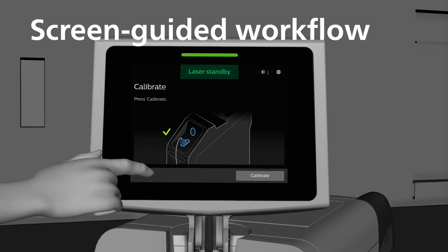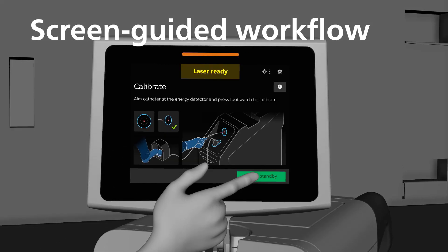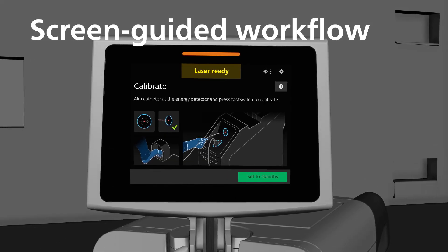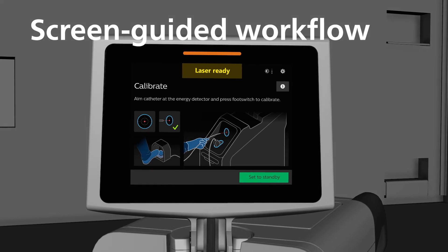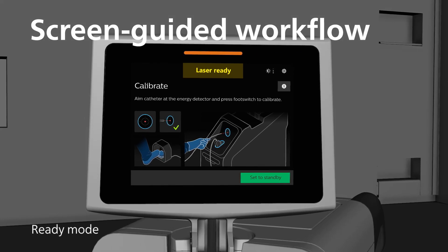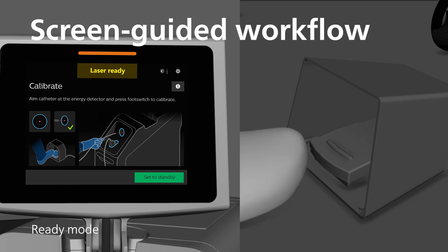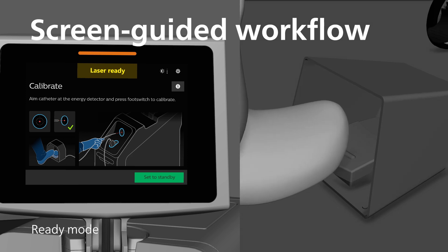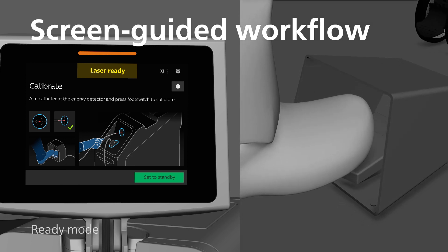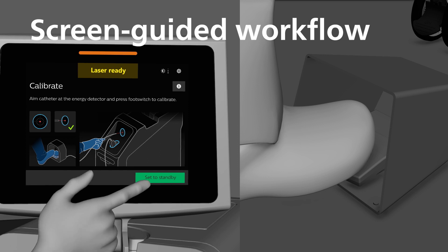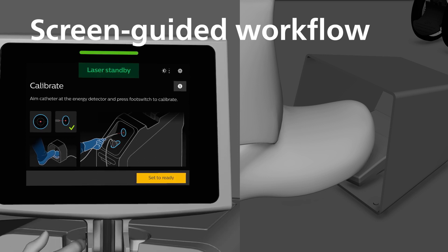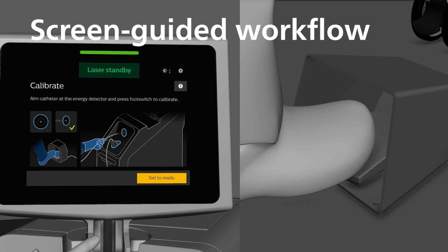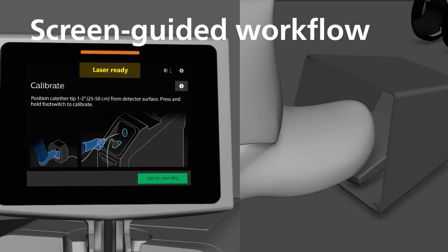To calibrate the catheter, select the calibrate button on the screen. Once the calibrate button is pressed, the system enters ready mode. The system will laze only when the foot switch is pressed while in ready mode. To enter standby mode, press set to standby. This will disable the foot switch. To continue, press set to ready to continue with calibration.